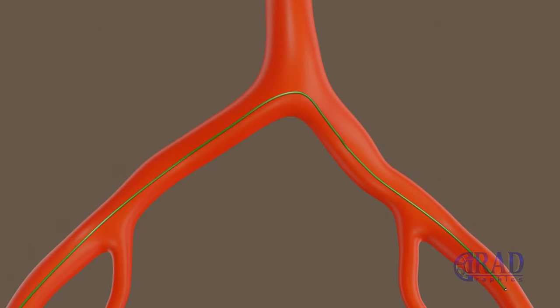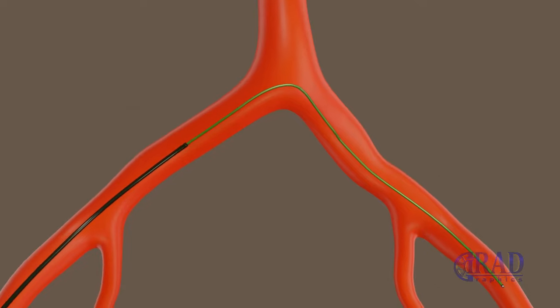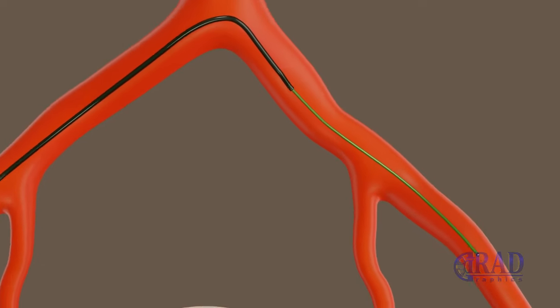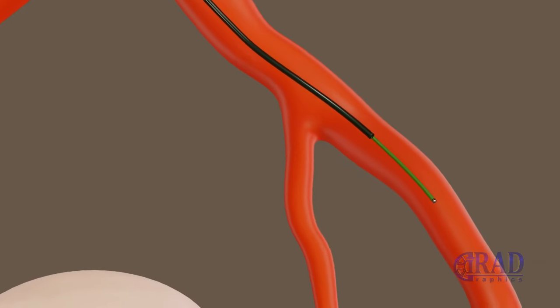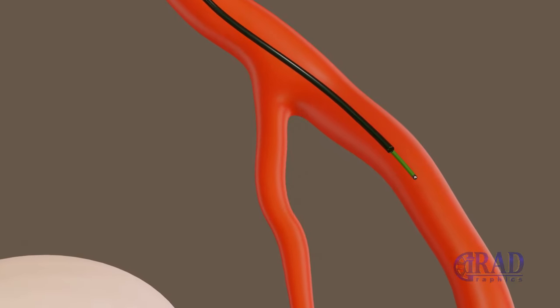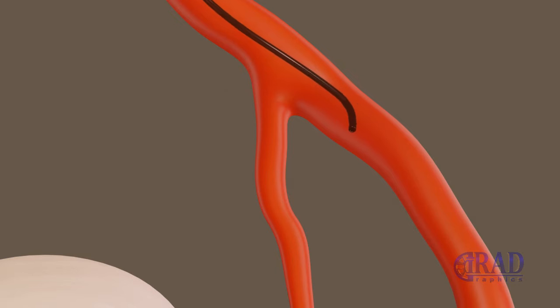Subsequently, the curved catheter is exchanged for an angled catheter, which is advanced over the wire to the contralateral side. Then, the wire is removed and the tip of the catheter is pulled until it is placed at the origin of the internal iliac artery.